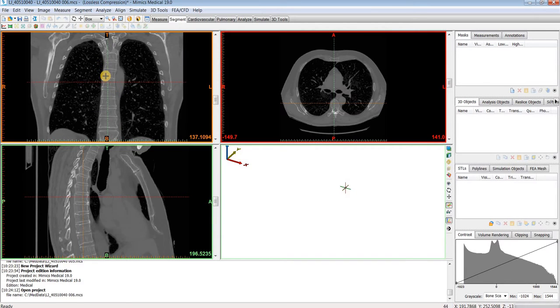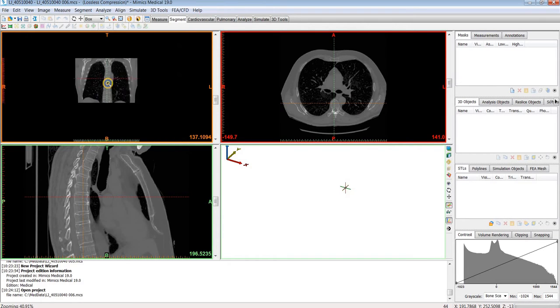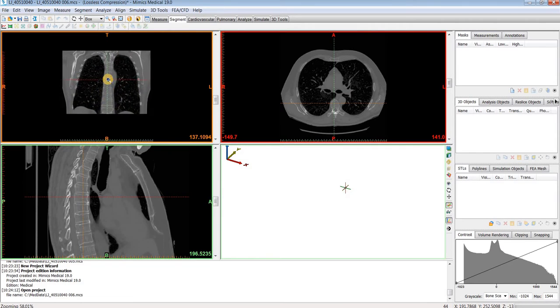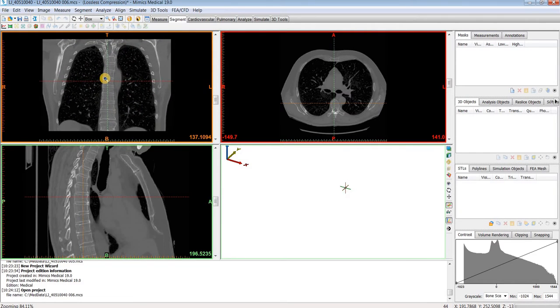Alternatively, you can hold down control right click and move your mouse and that will zoom in and out in a more interactive manner.